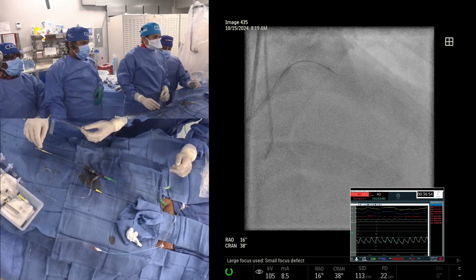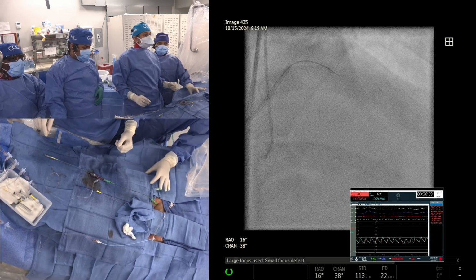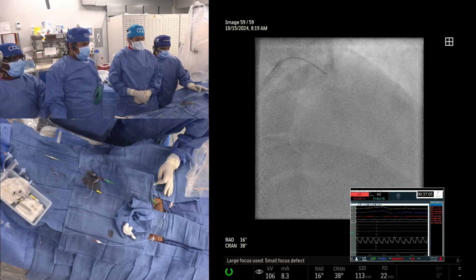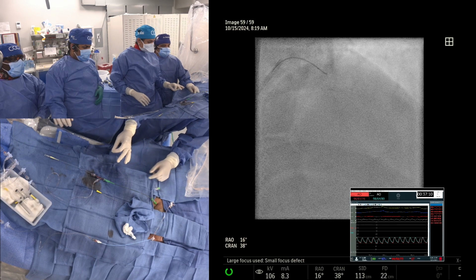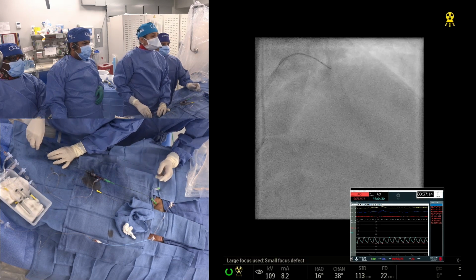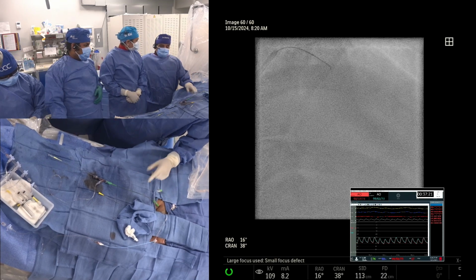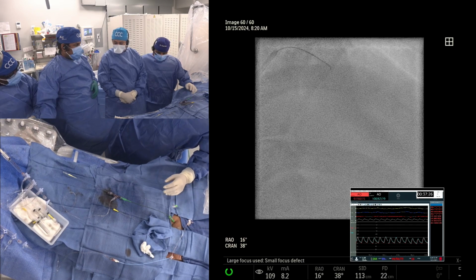Okay, tell us what you are doing now. I'm just trying to tell Samir how to decrease the radiation. See, I've got the collimators inside now. Look, this is the single easiest and most effective way to reduce radiation, which people don't use. And I'm so glad you're doing it. Most of your cases you do in how many frames? 15? Yes, it's still 15. Excellent.